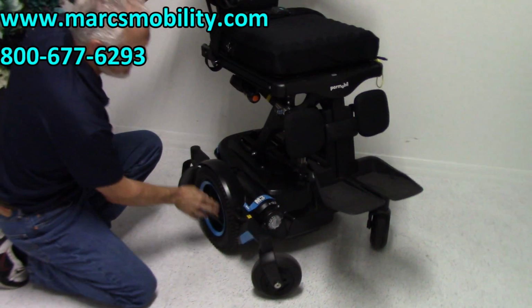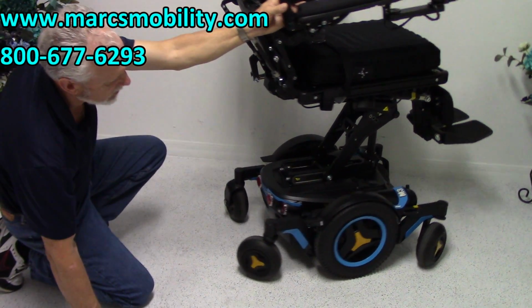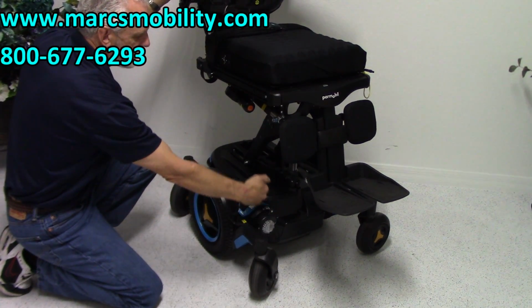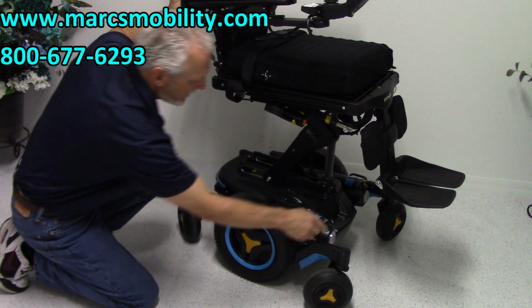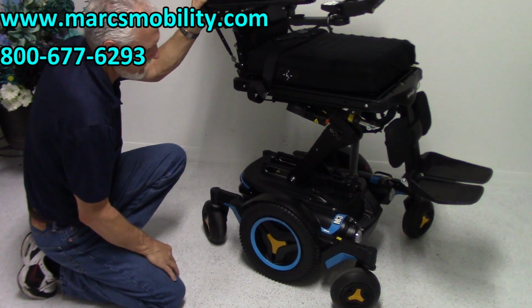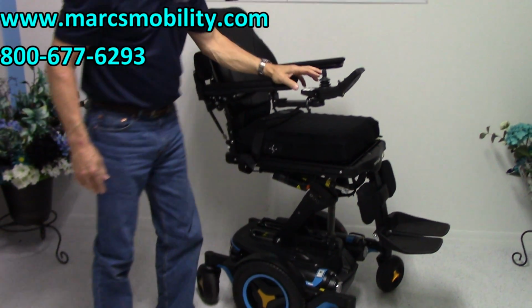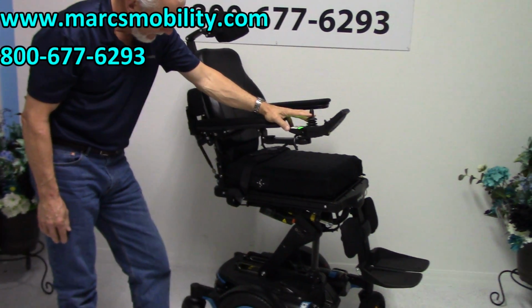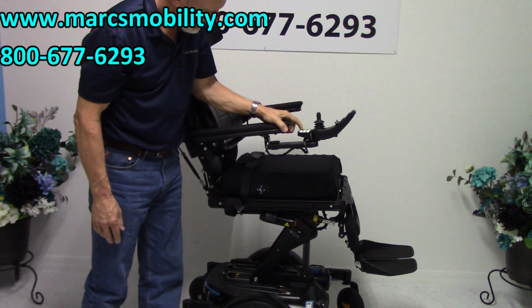What that does, it unlocks the wheel right here. Okay, so you have to do both motors. You have one over there, one over here. The motor goes this way, back to the wheel. That's how you put it in neutral. Flip it back, and you're back in gear. Okay? So far, we've covered the 12-inch seat lift. I'm going to bring the seat back down.